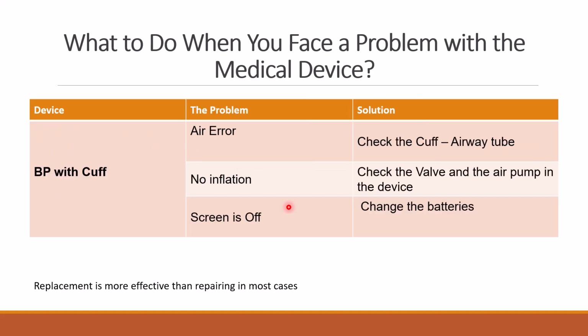Let's talk about the BP blood pressure monitor with the cuff. You have to keep it in your mind: any medical device deals with air and water or liquids.